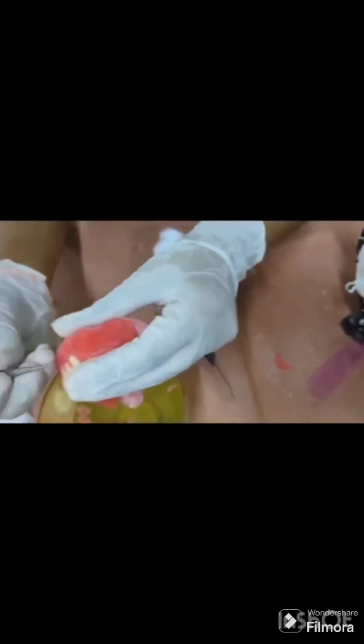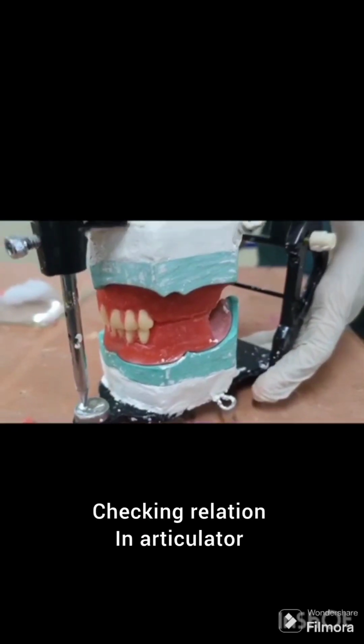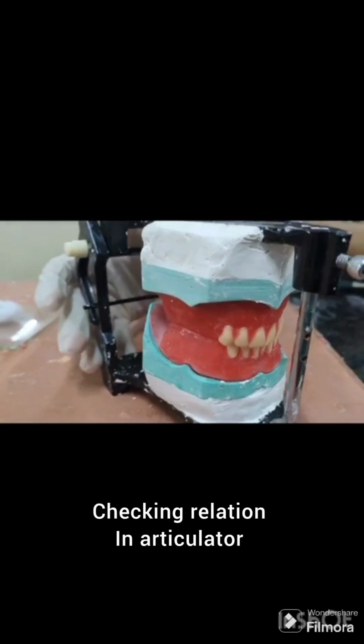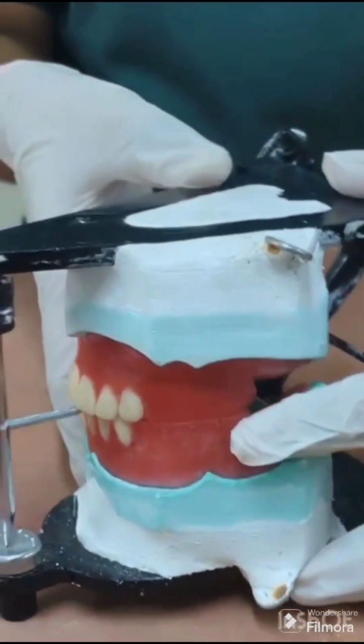From the lateral view, the incisal half of the canine is slightly lingually tilted and the cervical half is more prominent when viewed from the side. From incisal view, the cusp is slightly more than 2 mm above the occlusal plane. The arrangement follows the arch form. Once the anterior teeth arrangement is done on the upper arch and the lower arch, check the relation in the articulator.